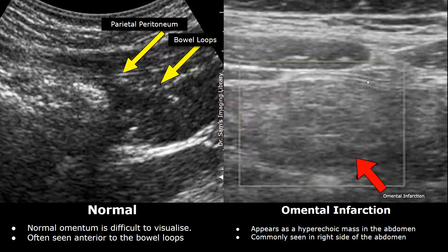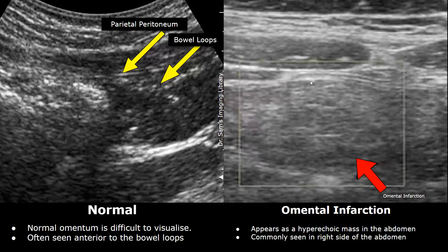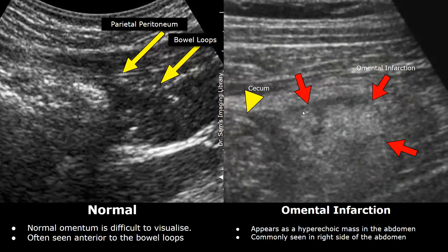Here is another case of omental infarction. A hyperechoic mass is seen in the abdomen. It will not show any internal flow on color Doppler. This image shows an omental infarction in the right lower quadrant — a hyperechoic non-compressible structure is present. After a CT scan, it was diagnosed as omental infarction. Normally, we will not see such types of masses in the abdomen.